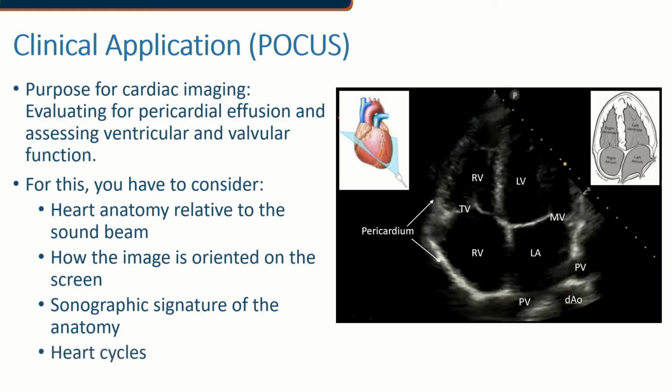All right, and last, you want to be sure you're considering your cardiac valves, because we want to be able to see how those valves are functioning. You'll note that the tricuspid valve in its relationship to the mitral valve will be just a little bit more inferior to that mitral valve, and in the case of looking at it from this angle, it'll appear like it's a little bit more anterior than the mitral valve, if you're using those as orientation.